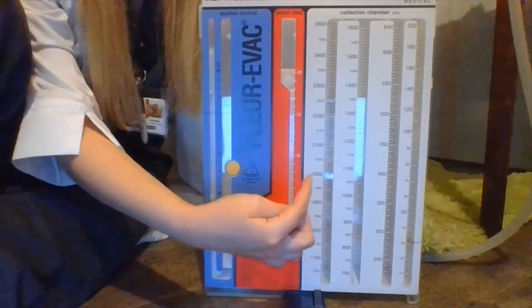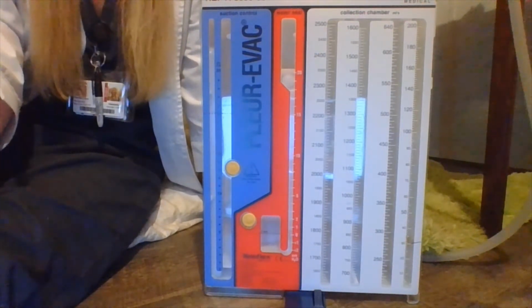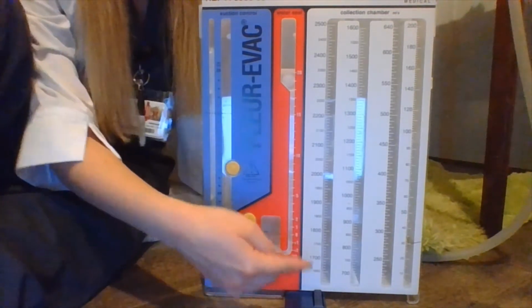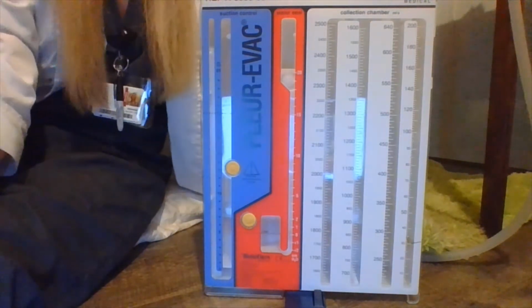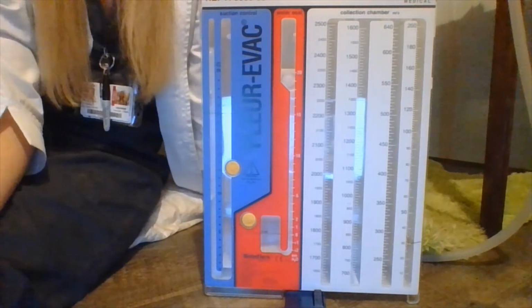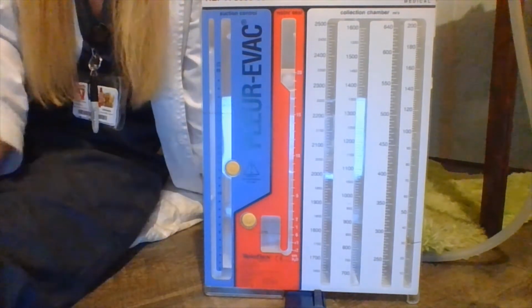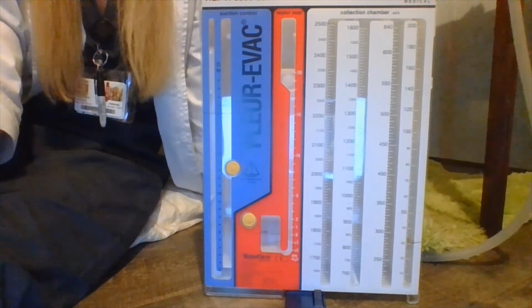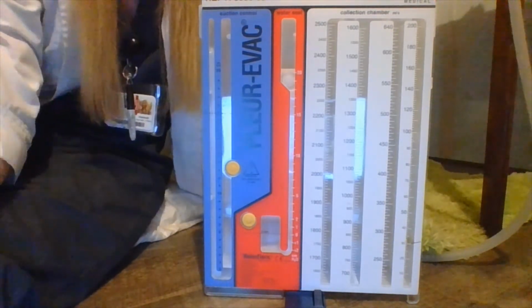The water seal chamber here in red allows air to be removed from the pleural space without air being allowed to enter the body because of negative pressure. The water level increases during inspiration and decreases during expiration, but it's the opposite if the patient is on positive pressure mechanical ventilation. If they're on mechanical ventilation, the water will increase during expiration and decrease during inspiration. If the water does not fluctuate at all, the lung may have re-expanded, or there could be a kink somewhere in the tubing, so it's important that you check for that.